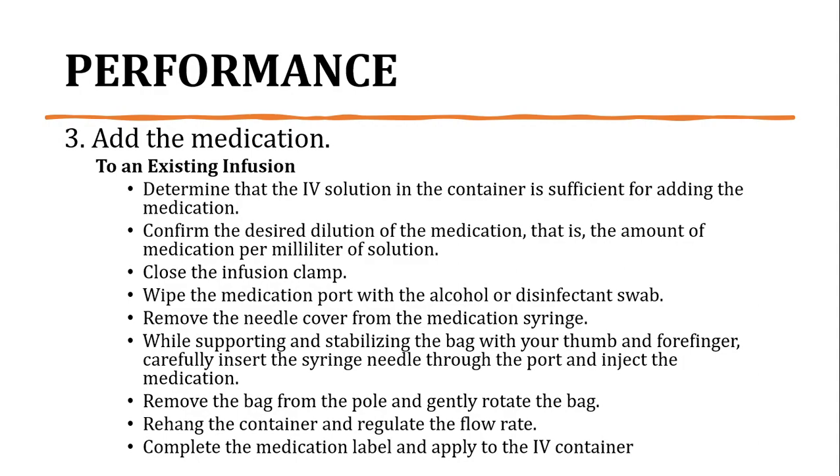Confirm the desired dilution of the medication, that is the amount of medication per milliliter of solution. If bawas na po, kailangan i-calculate kung ilan yung tira doon sa intravenous fluid container, IV bag niya, para ma-calculate kung ilang medication yung ilalagay based on dilution, based sa kailangang dilution ng medication na ilalagay doon.